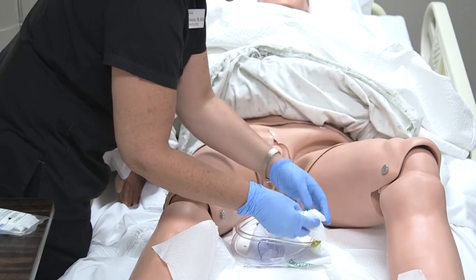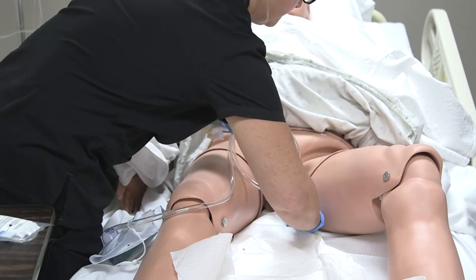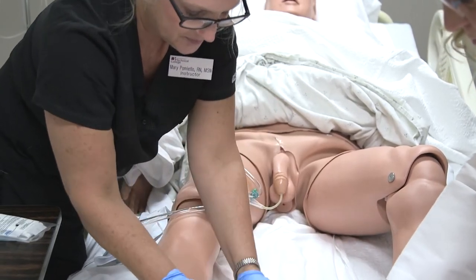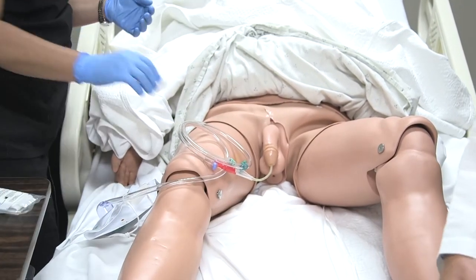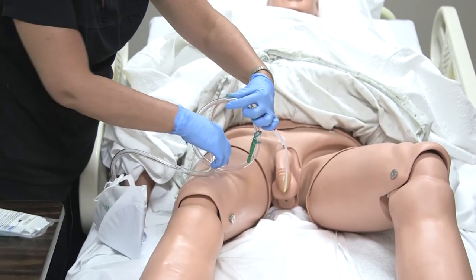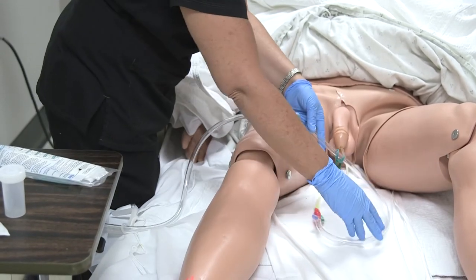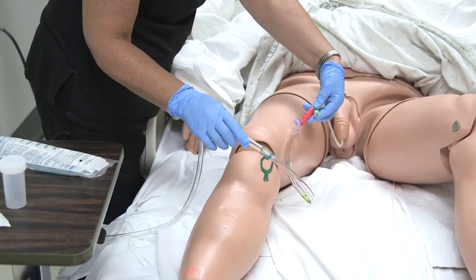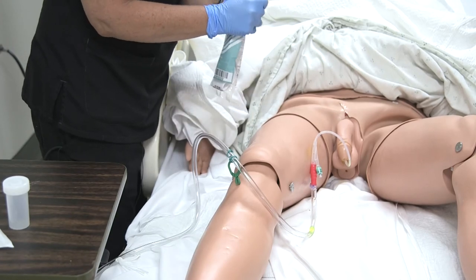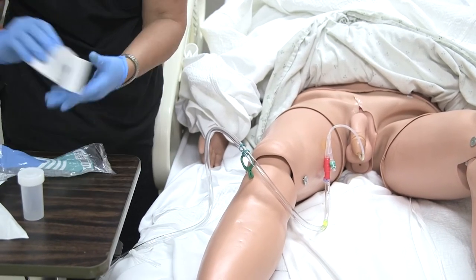You'll have to follow your facility's policy on doing catheter peri care as directed. All right, so now that we have our catheter in, I'm just going to show you how we attach that. Sometimes you get a mess, but it won't be the first time. When we attach our urine bag, again, make sure that it is coiled freely. And a lot of times there are stat locks that you'll see at the hospitals. Here is a kind of Velcro stat lock for your tubing. That just keeps the catheter from being tugged at and possibly coming out.